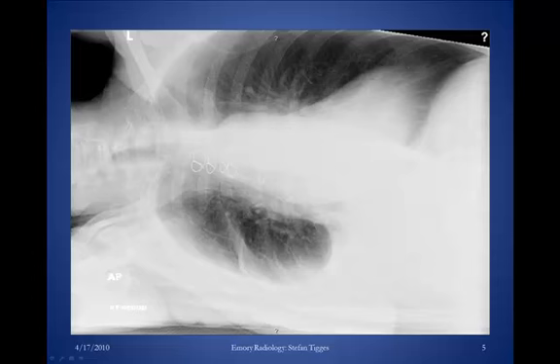Sometimes you might not be sure that there's a pleural effusion present, or you may want to determine whether the pleural effusion is free-flowing or not. One thing you can do is get a decubitus view — the patient is lying on their side as opposed to being upright or lying on their back. This is a right decubitus film, meaning the patient is lying on the right side, and the pleural fluid is tracking up the right lateral chest wall. You can even see a little bit of it going into the minor fissure.